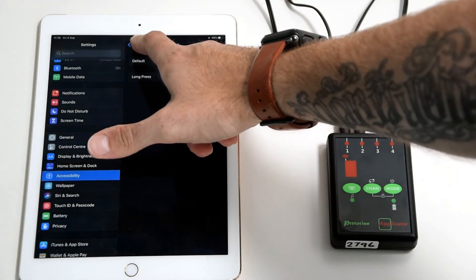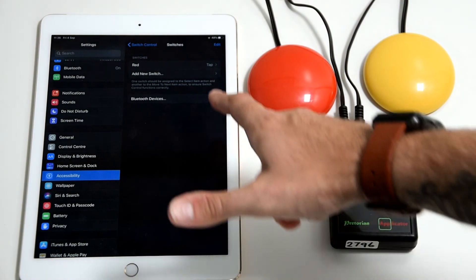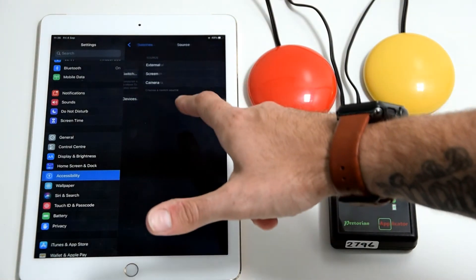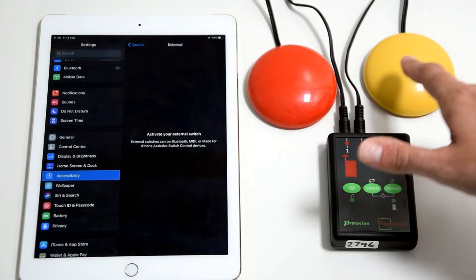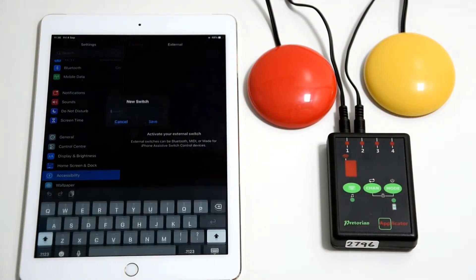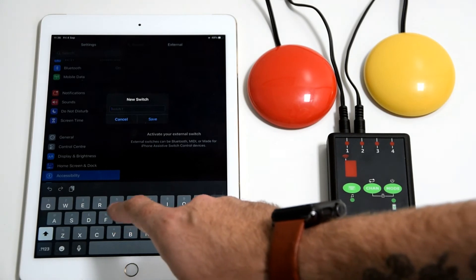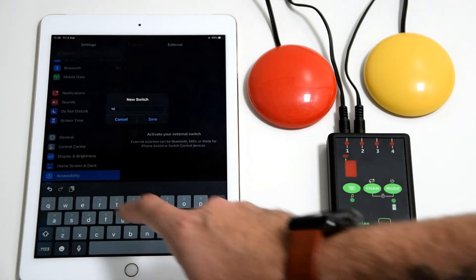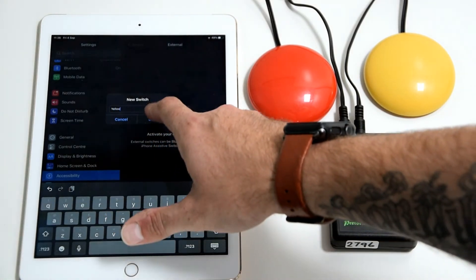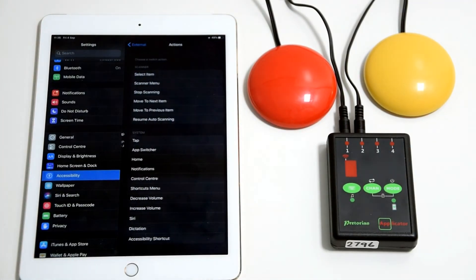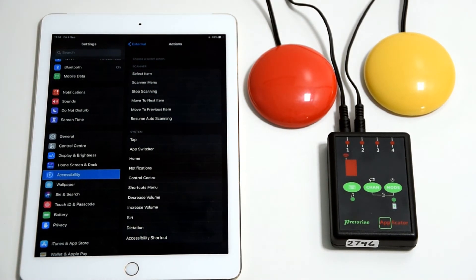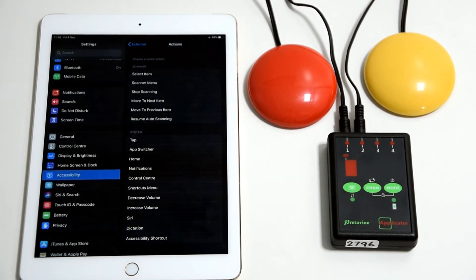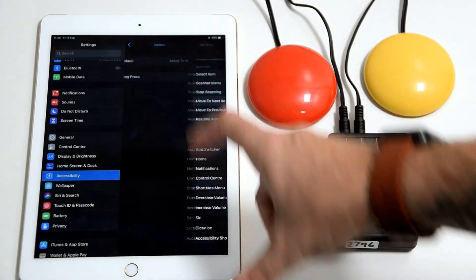Then we'll do the yellow one external and then hit the switch again. This one we'll call yellow, and then in this menu, to manual scan. To use it as a manual scanner, you need to have it as move to next item.